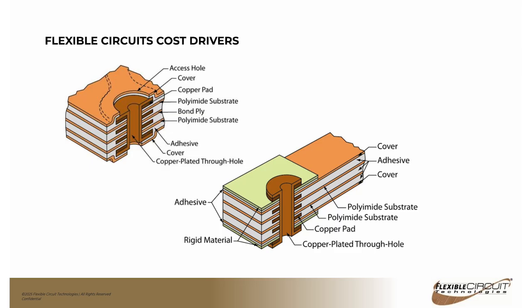Well, I would dispute that. I've designed a lot of flex circuits, and there's always other ways that you can connect the dots. And there's also things you can do with how you maybe form a flex circuit. If you need to have a particular arm that goes off at a right angle, it's possible that you could run that up out the side and then turn it, and then in the application you'll fold that flex arm over. So there are things that can be done, and I highly recommend that you give us a call if you have an application like that, because we do have a lot of tricks on how to optimize panel layout and your circuit size and shape, and we'd love to discuss those with you.